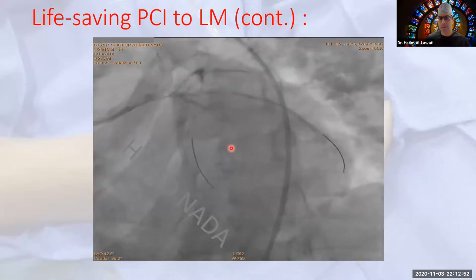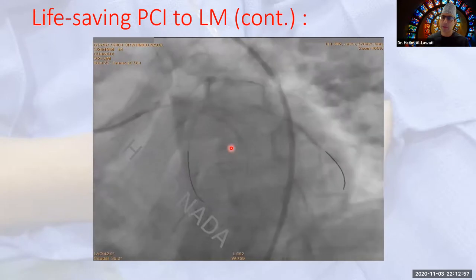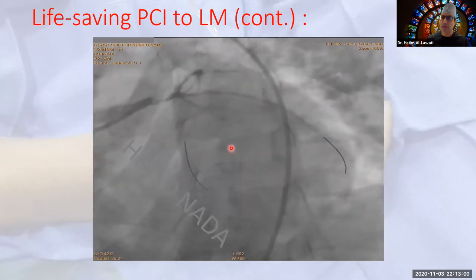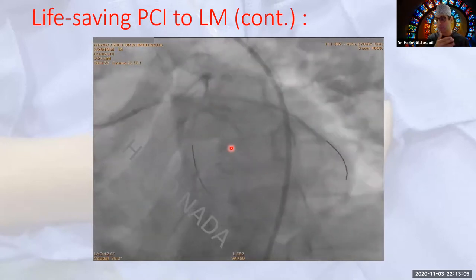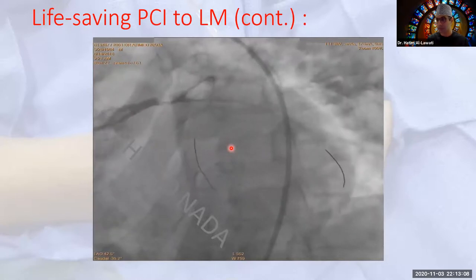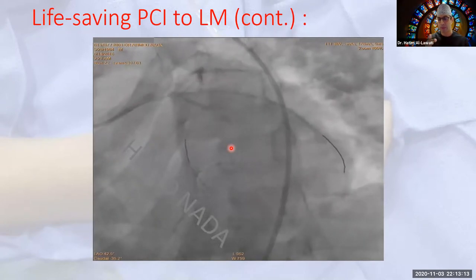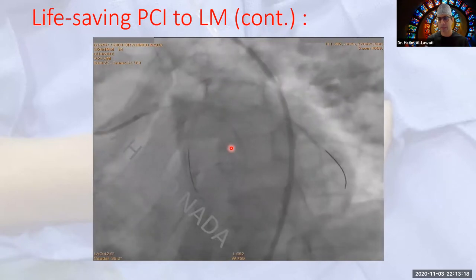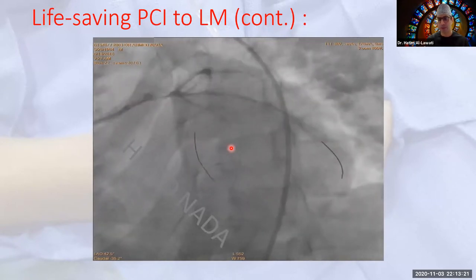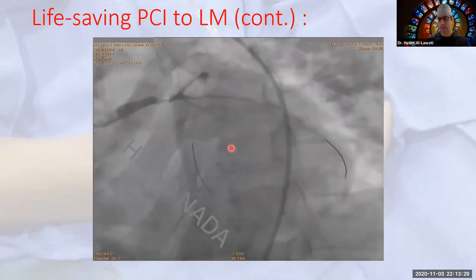I would be thinking twice about placing a stent at this stage in time because, I mean, you could potentially establish flow in the proximal conduit in the left main and the proximal LAD, but you have no idea what would happen once a stent is implanted. You could embolize downstream. You could cause severe no reflow, not only in the LAD, but also in the ongoing ramus and the circumflex, and end up with a dire situation, equally difficult. So I would hesitate to place a stent before I see better flow, either with more pharmacology.